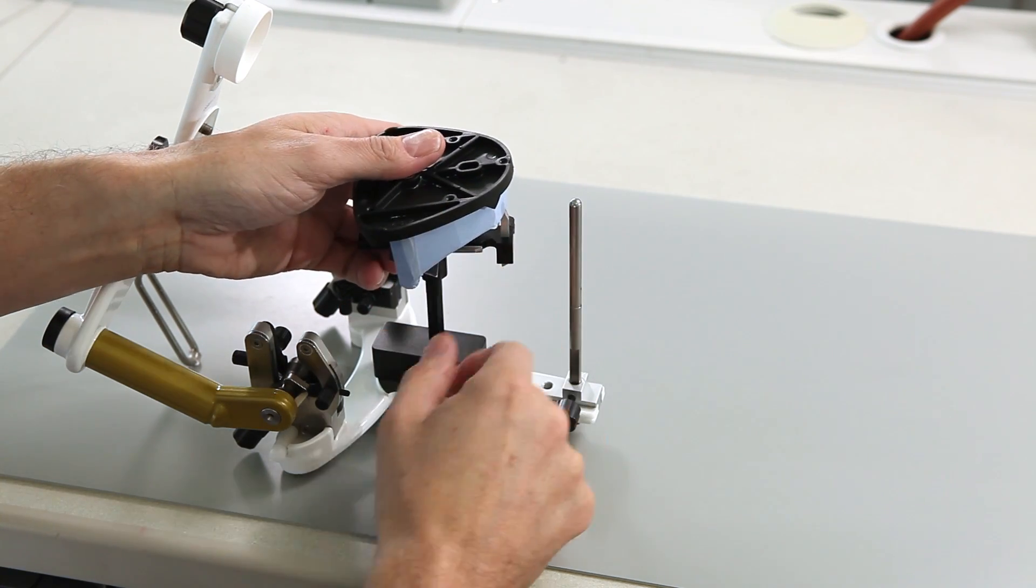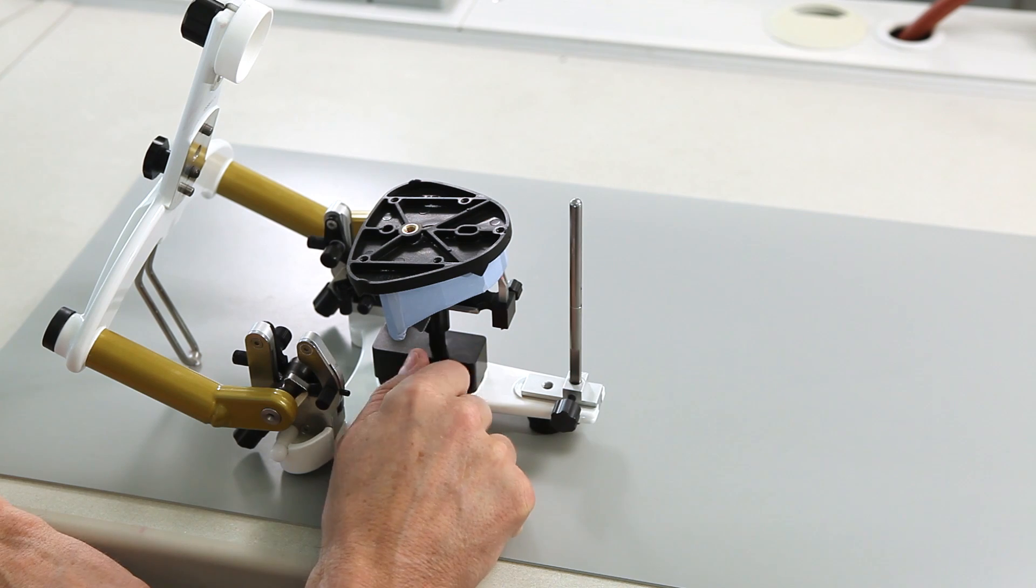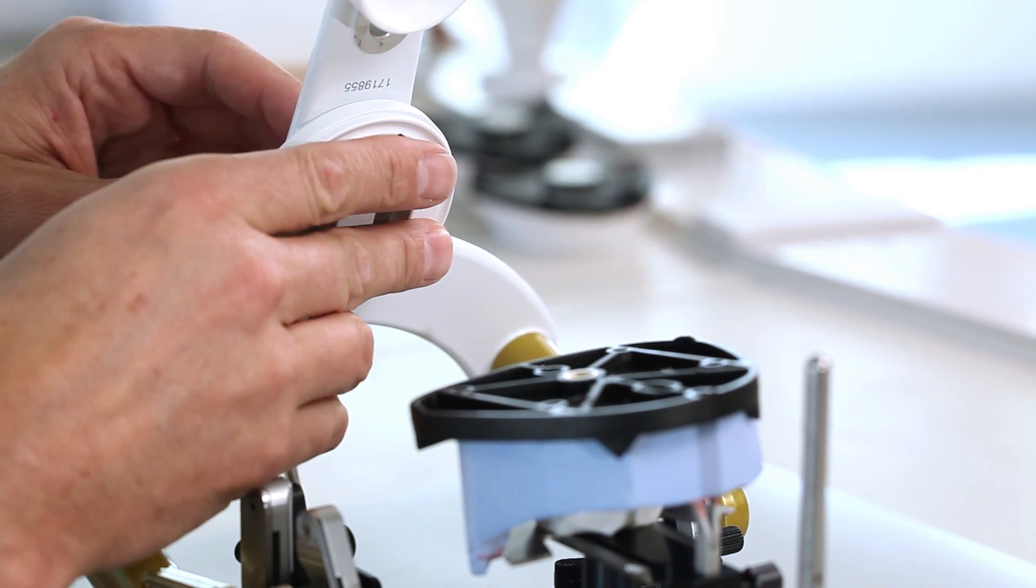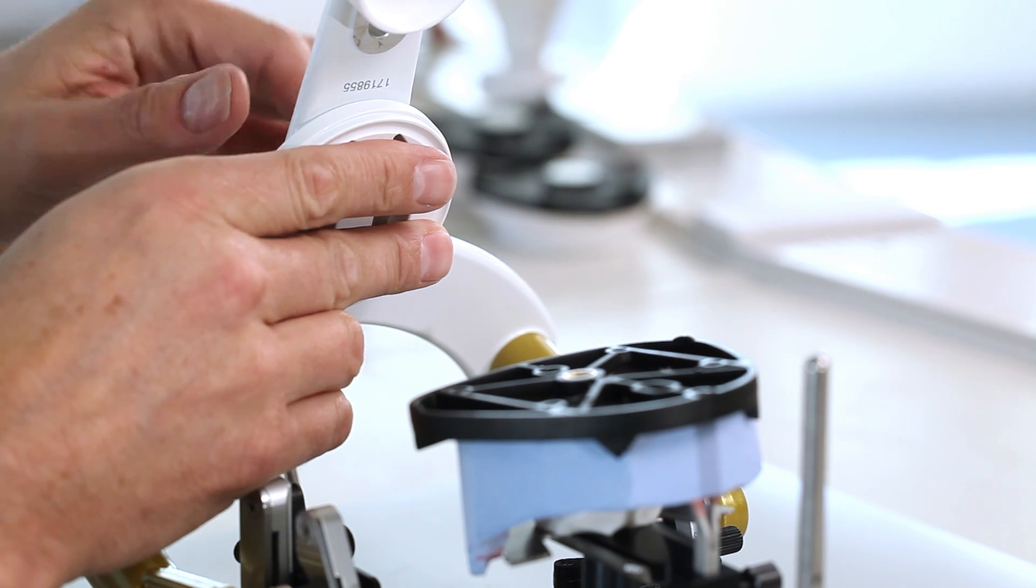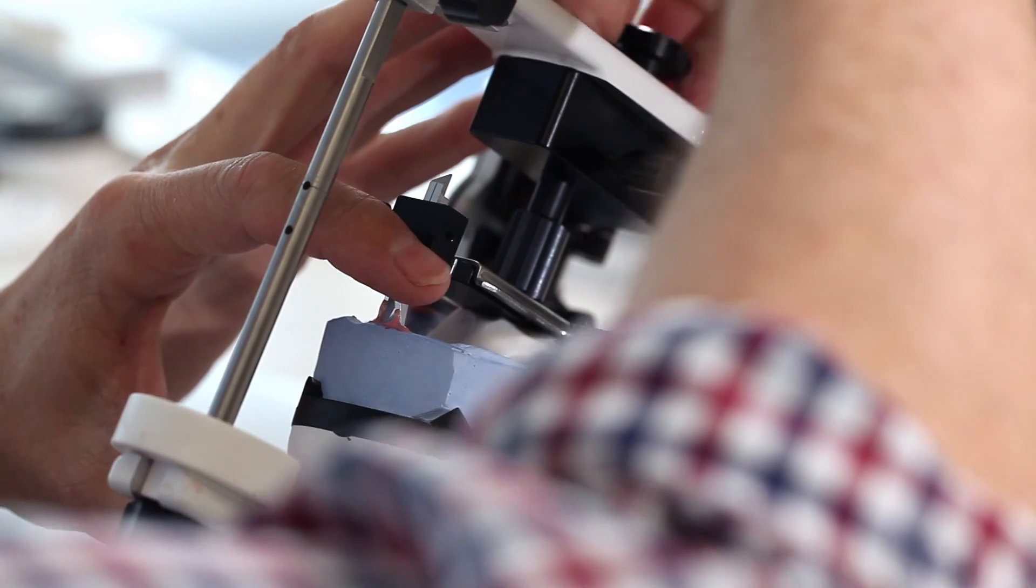Mount the horizontal guide in the articulator with the help of the instrument carrier. Mount the base plate in the articulator and secure the mandibular model using dental plaster. Wait until the plaster has set.